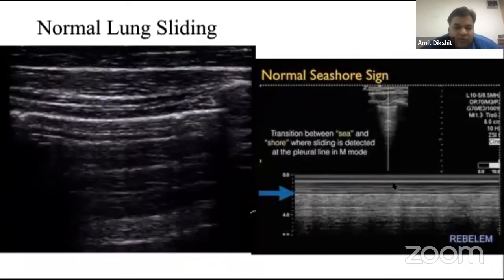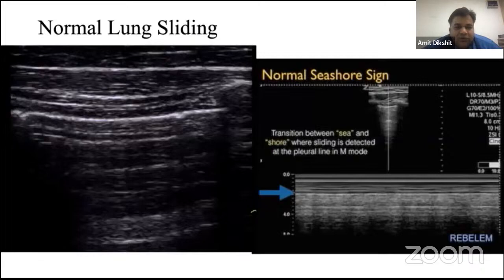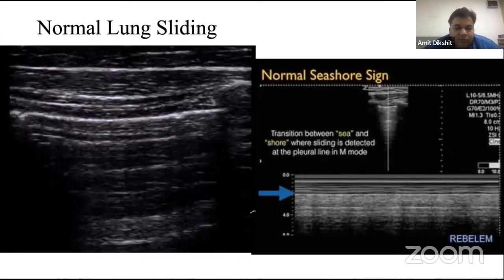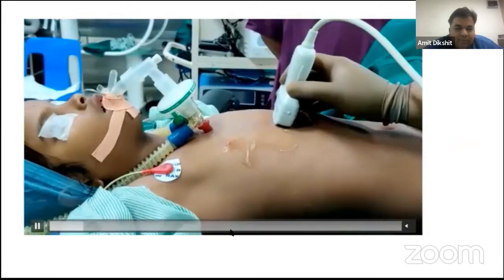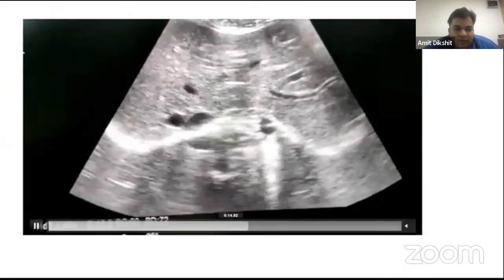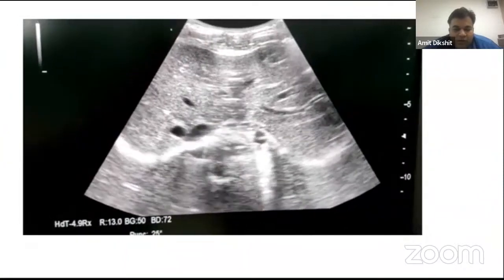Now, this is useful when we are doing DLT, though the gold standard for DLT is definitely pediatric fiber optic intubation, the use of a pediatric fiber optic scope for seeing the blue cuff and everything. But for this technique, there was a paper from Tata Memorial Hospital, Mumbai, by Dr. Jigi Diwati and group, where they proved that it is better than auscultation. So ultrasound is superior to auscultatory methods, and you can see whether it has become endobronchial or not just by placing the probe. In the pediatric population there is another advantage: because the sternum is not calcified, you can even see the movement of the diaphragm very well. Nowadays most machines have a click button, you can change the probe and see whether it is moving or not, and confirm.